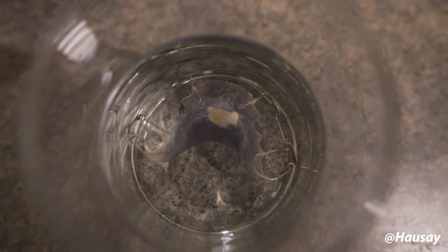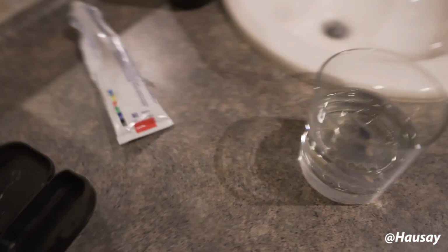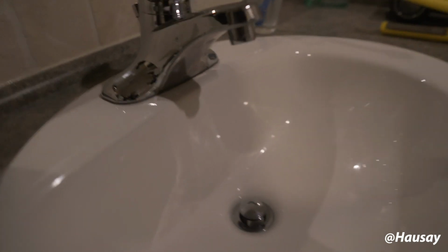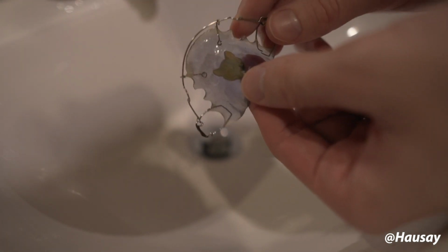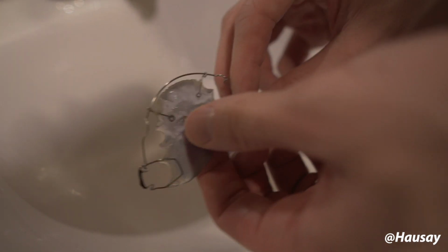So it's been about 30 minutes and it stopped bubbling a little bit ago. But yeah, now the next step is to drain all of the water out of it. And then I'm gonna need 2 hands for this next point, so let's pop you guys right here. So you can already see a difference from where it was before, it's already clean, but we're gonna take it one extra step.